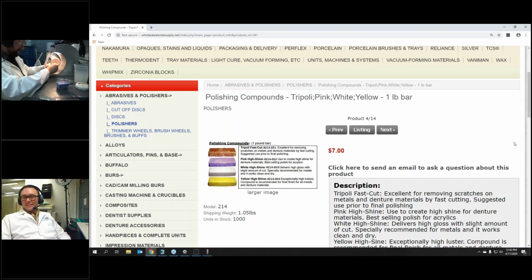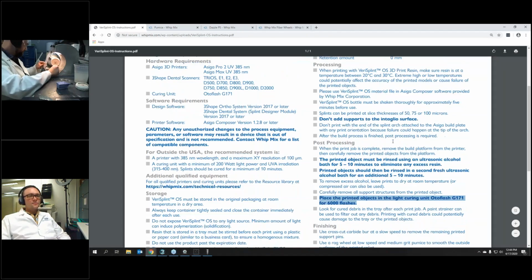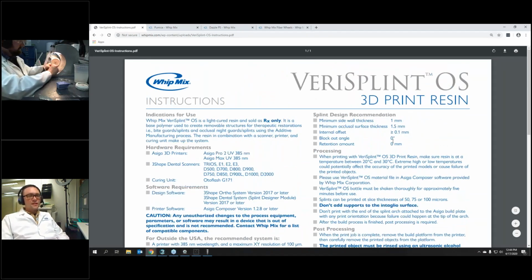We had a question from Anthony. As I finish my guards now, I like to bevel the labial surface. What's the minimum material thickness, thinness tolerance? So we can go back to the IFU. And again, I do apologize. I have the IFU from our website, not the most current one, but that should be getting switched out pretty soon. So these values aren't quite right.